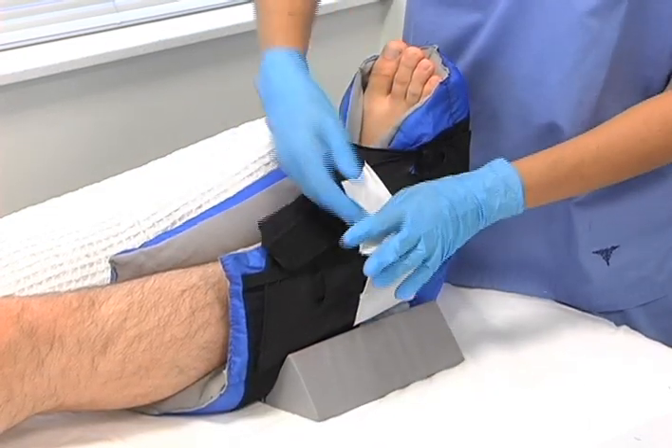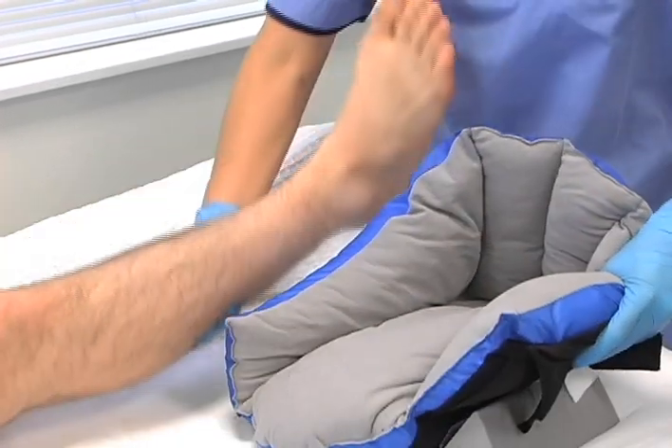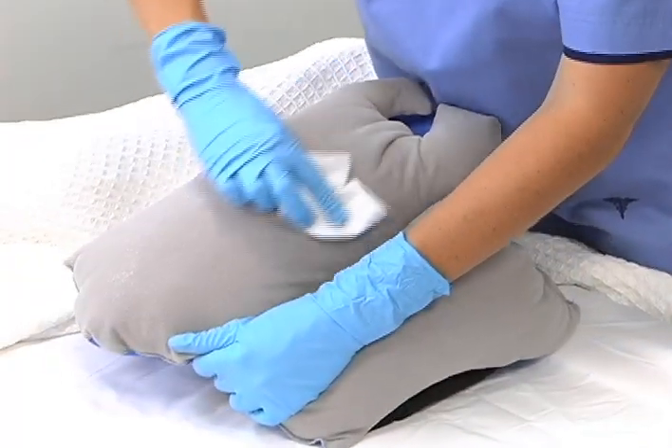Prevalon should be removed periodically to assess skin according to your protocol. To remove, simply detach the stretch panels, remove the boot, and turn it inside out. This makes it easier to position the heel while putting Prevalon back on. A damp cloth can be used to wipe down the boot.